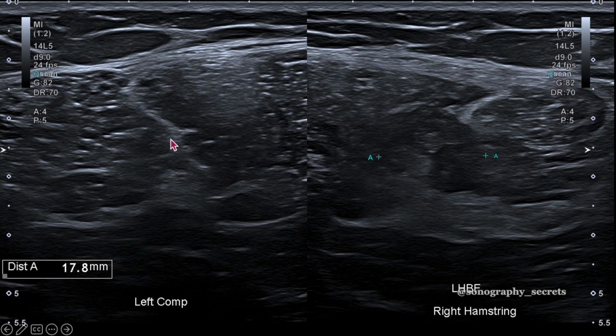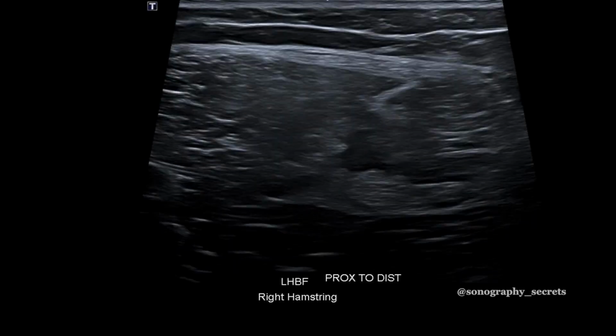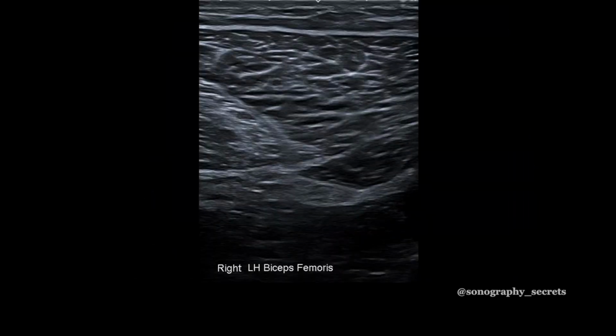I can identify what is normal, and that provides a really good baseline for when you have some more subtle injuries in which you're not quite sure. So as we scan down, again, if we rock our probe from side to side, just to try and get the best angle, we can pick up any defect through that tendon.